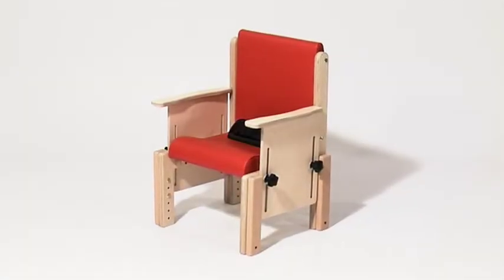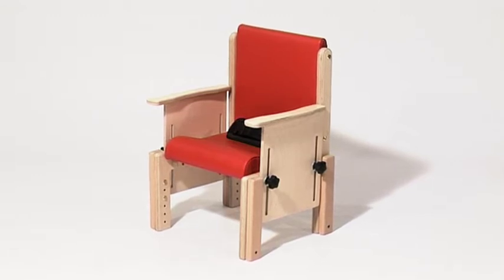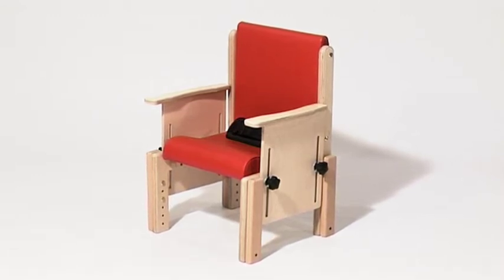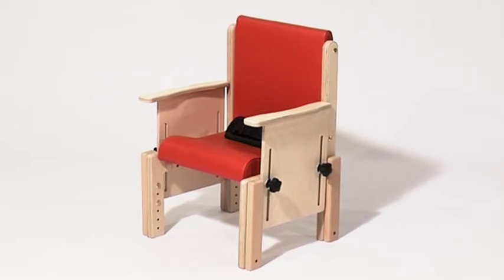The Heathfield is our popular starter chair. Its unobtrusive design means that it fits well into the nursery, school and home environments. The Heathfield is easy to clean and easy to adjust.